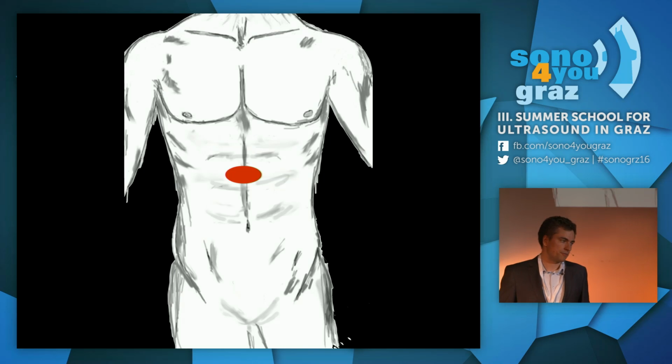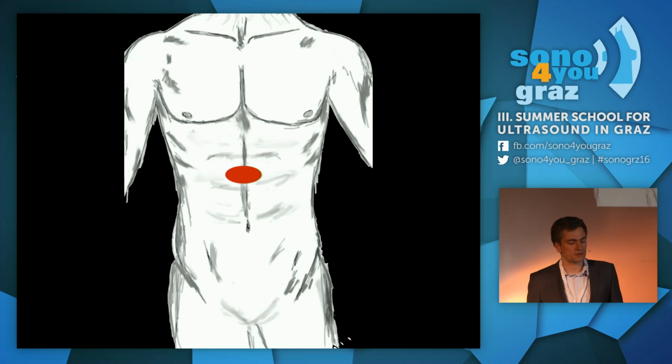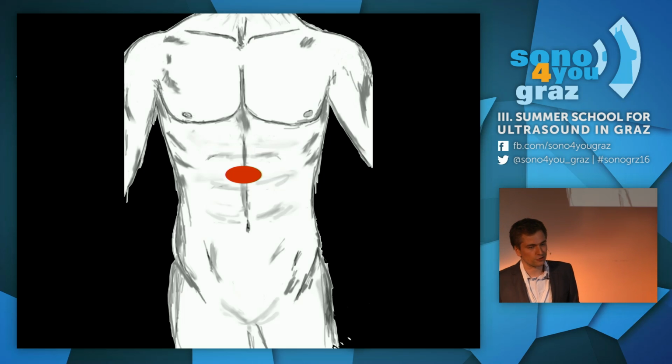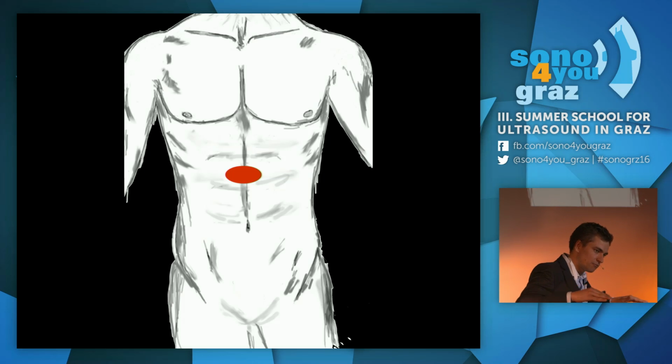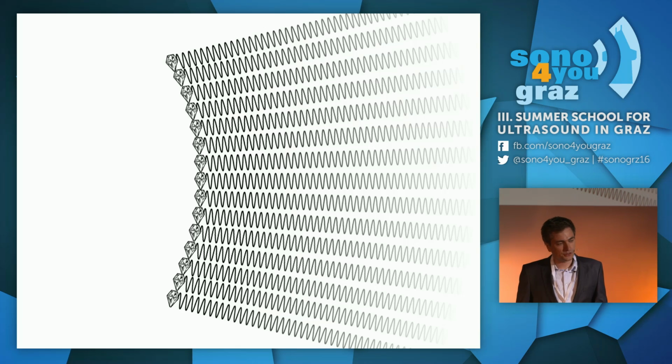The next scenario. You want to do an abdominal ultrasound, looking for some big vessels, for example, the vena cava. Especially if you look at our population in Austria, with all the big bellies, you may need crystals penetrating a little more deeply, as you can imagine. And that's exactly what you do. The other thing you do is not line them up in one line.